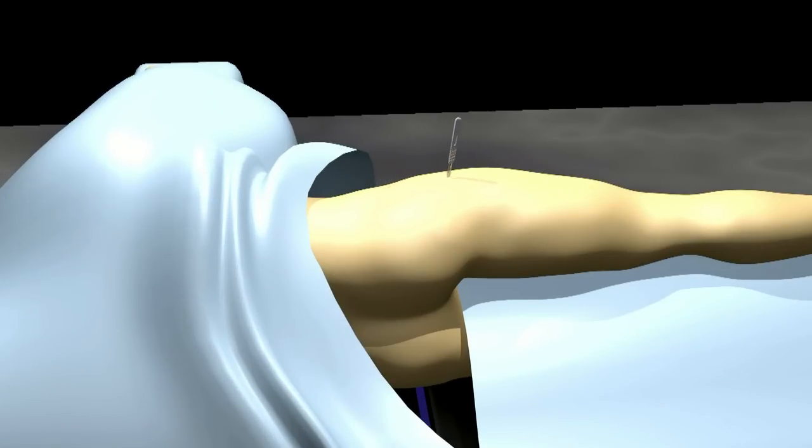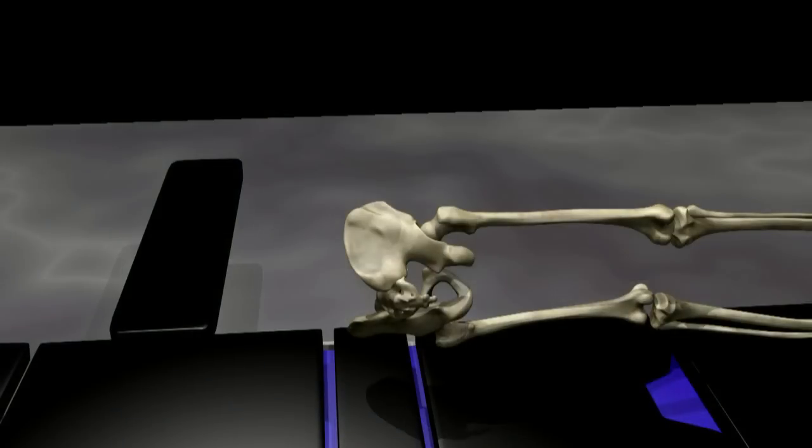An incision is made over the hip joint. The skin is pulled out of the way and the muscles surrounding the hip joint are carefully dissected in order to expose the joint.